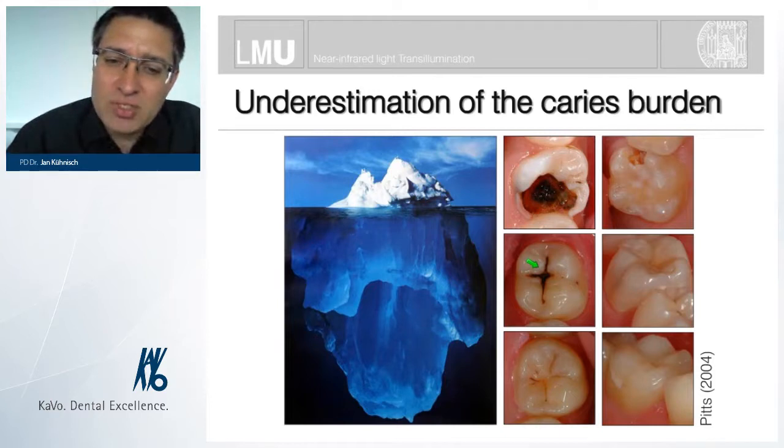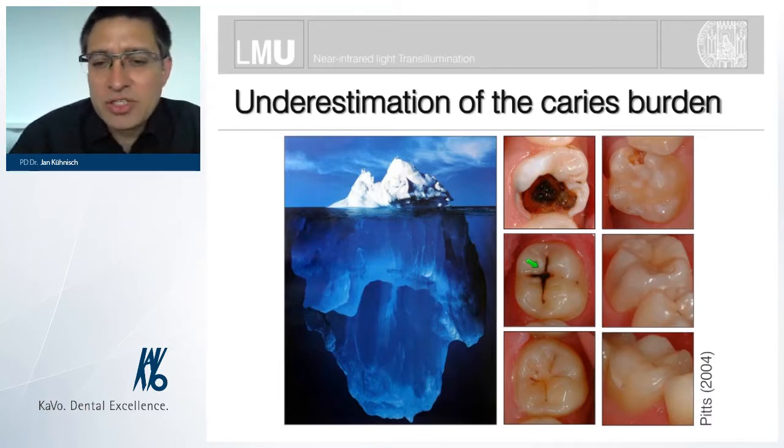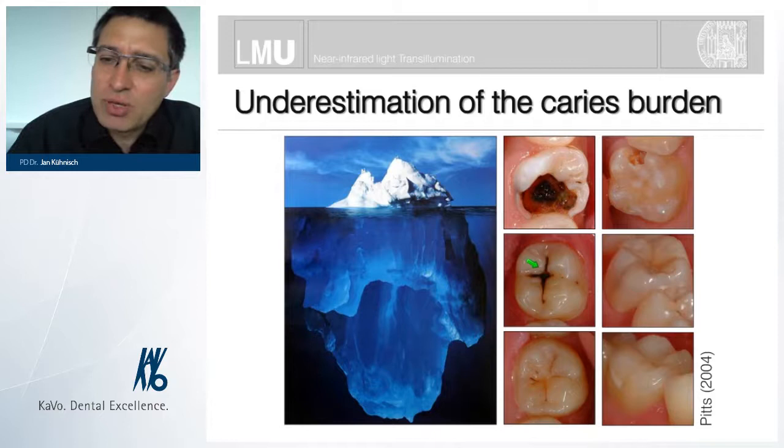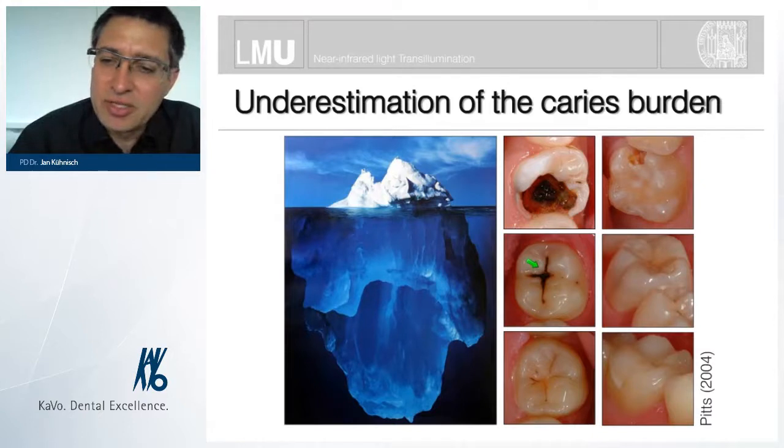Furthermore, if we go one step deeper into the sea, then we can detect the first visible stages of caries, maybe a small discoloration in pits and fissures, or lesions which are more or less inactive in some elder patients. This image comes from a 12-year-old who has learned to brush and clean the teeth, and you see that the non-cavitated caries lesion is not located anymore at the gingival margin, which is more or less the high-risk area on such teeth.